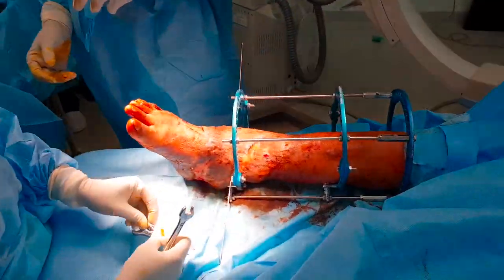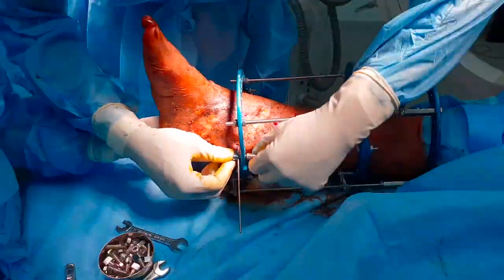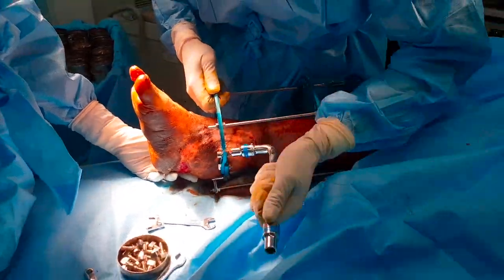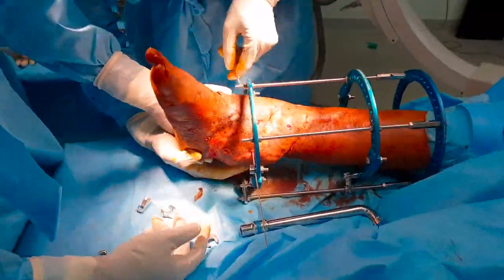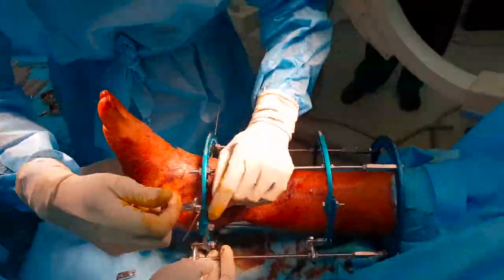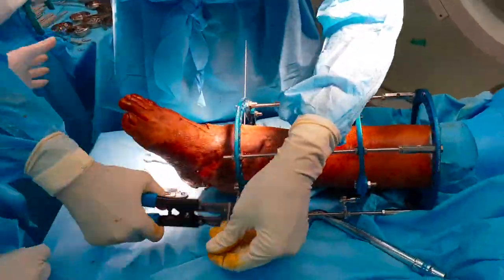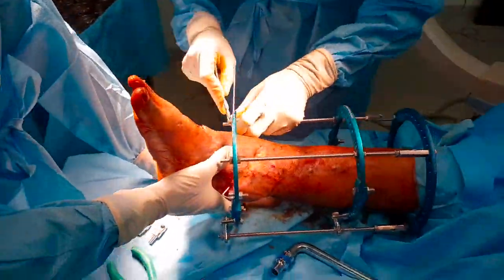Here we are going from medial to lateral. One end of the wire is anchored to the appropriate hole and tightened. A C-arm is once again taken to ensure that the ring is at the correct level. The key is that the ring and wire should be parallel to the ankle. The opposite end of the wire is anchored with a wire fixation bolt, one end fully tightened, the long protruding edge trimmed and the wire twisted.